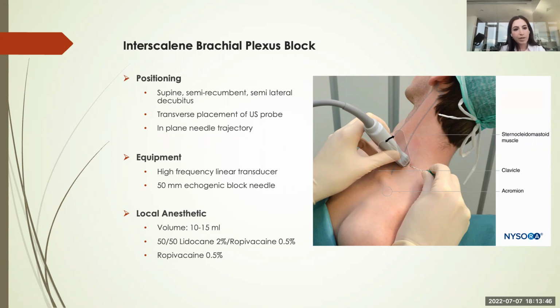With respect to landmarking, the probe is usually placed on the anterolateral neck behind the clavicular head of the sternocleidomastoid muscle, as you can see here, about 1 to 2 centimeters above the clavicle.